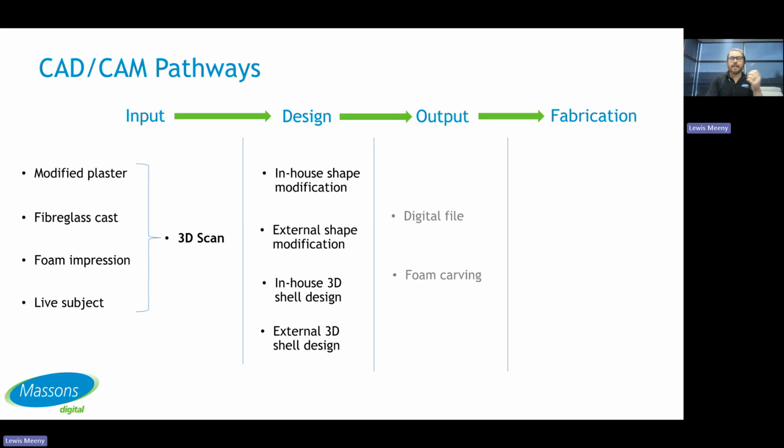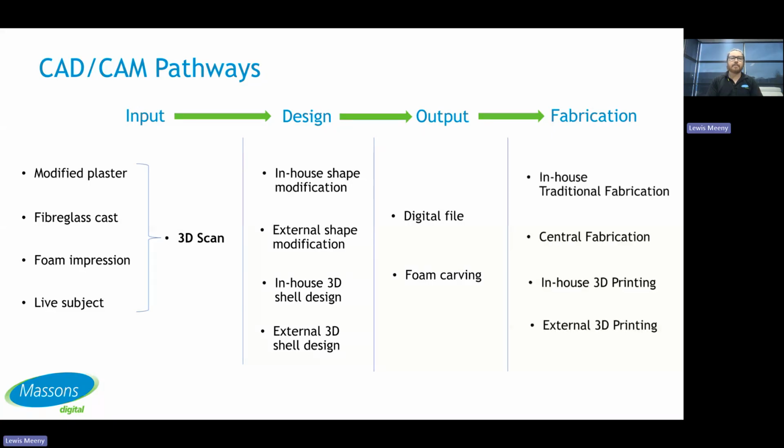Regardless of how we design, we're going to end up with a digital file. Potentially that could go straight to a foam carving as well. So depending on the workflow you're going to do, the file or the carving might be your next point of output. From that, we're going to have our fabrication.